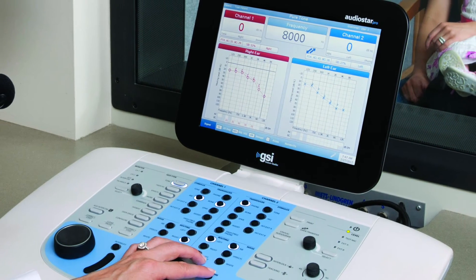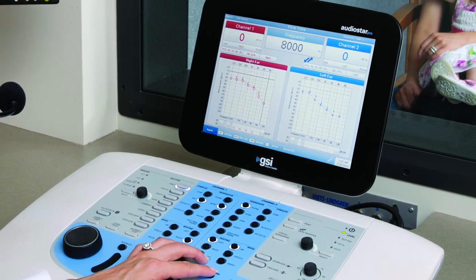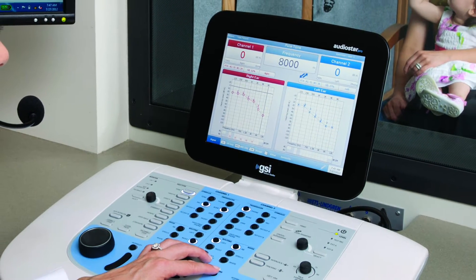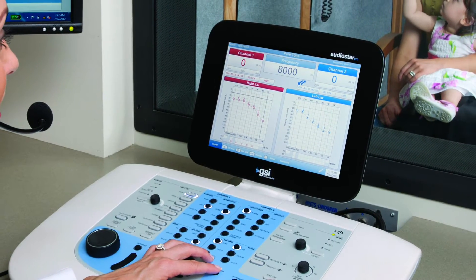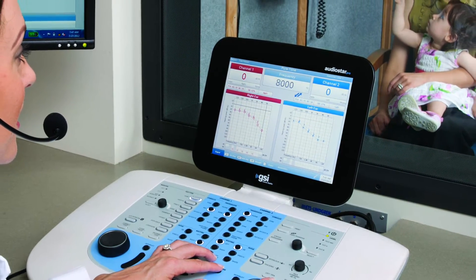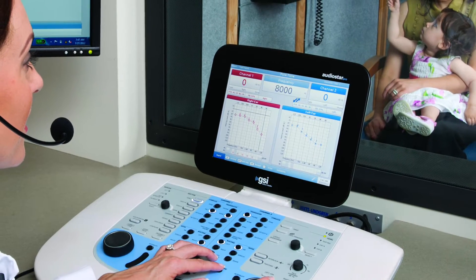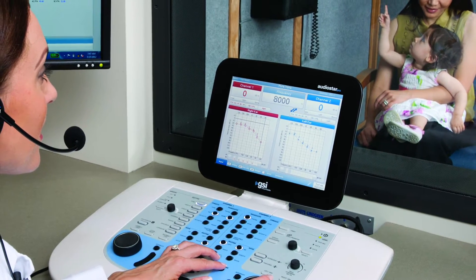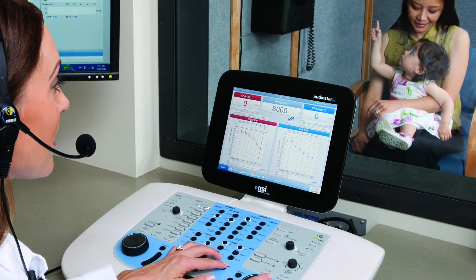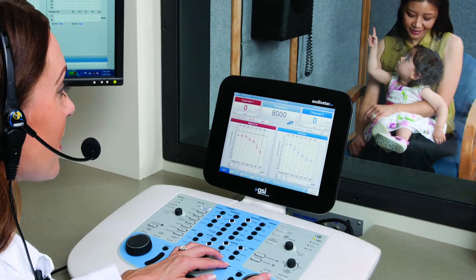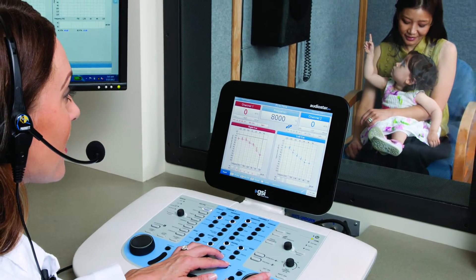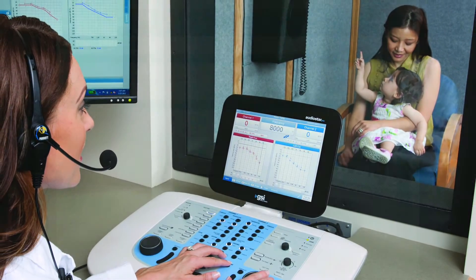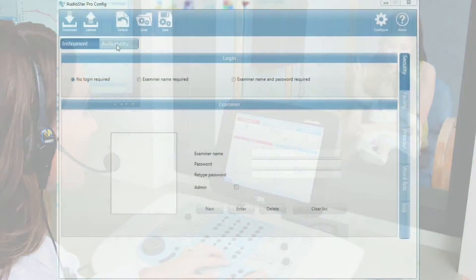It is possible to customize pure tone audiometry to increase testing speed and efficiency. Using the AudioStar Pro configuration software, the ability to select specific frequencies to be tested, the order in which they occur, and automatically advancing to the next test frequency can be enabled.